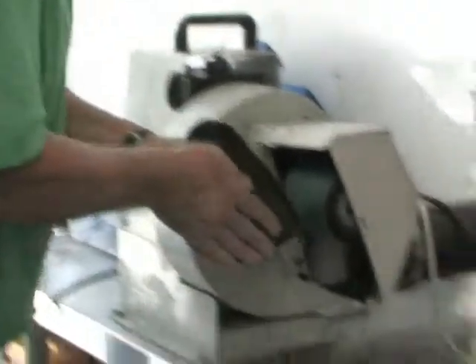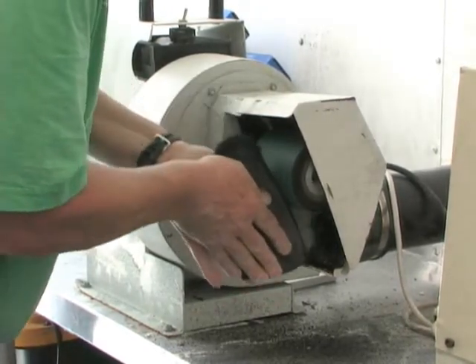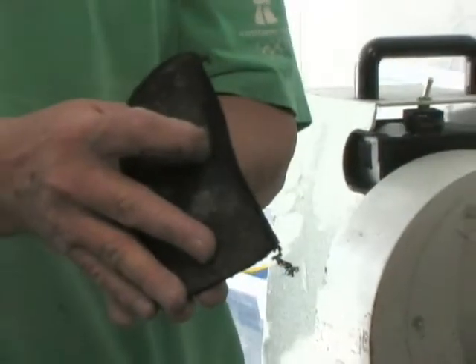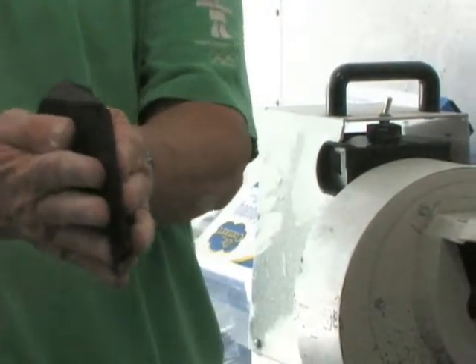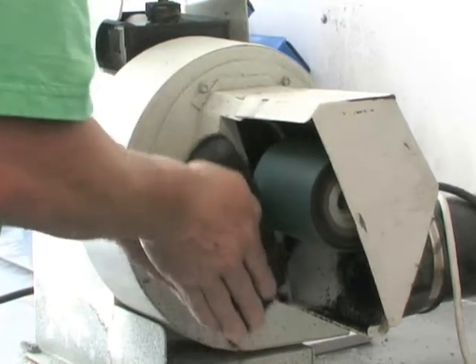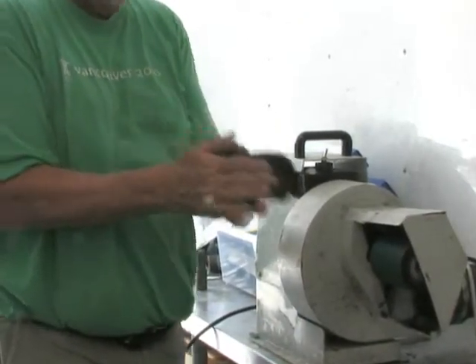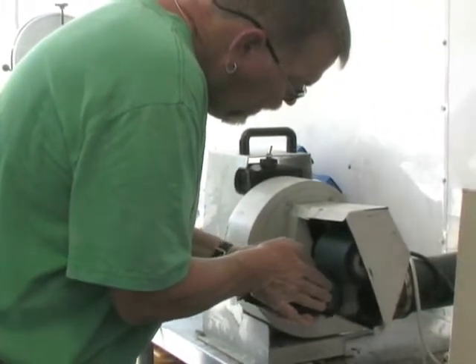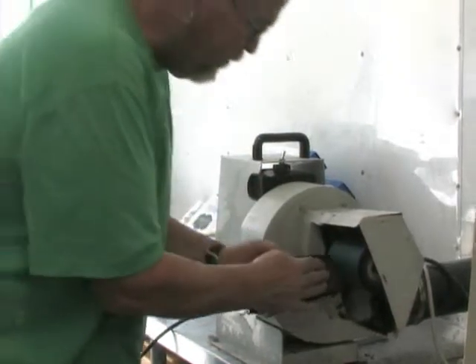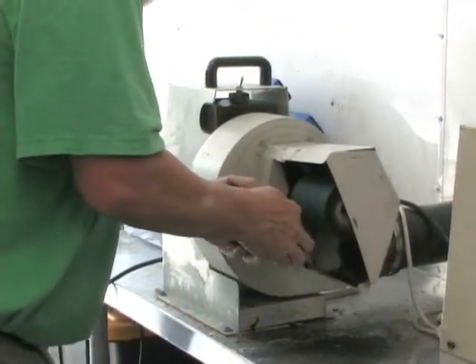The way you approach the grinder is like this, between your hands — that way you can control it and your hands aren't close to that grinding wheel. I go all the way along the medial border just like this. Then go along the lateral border. I need to go around the heel cup — turn it around. Always make sure you can watch where you're grinding. Turn it over, go back in the other direction.